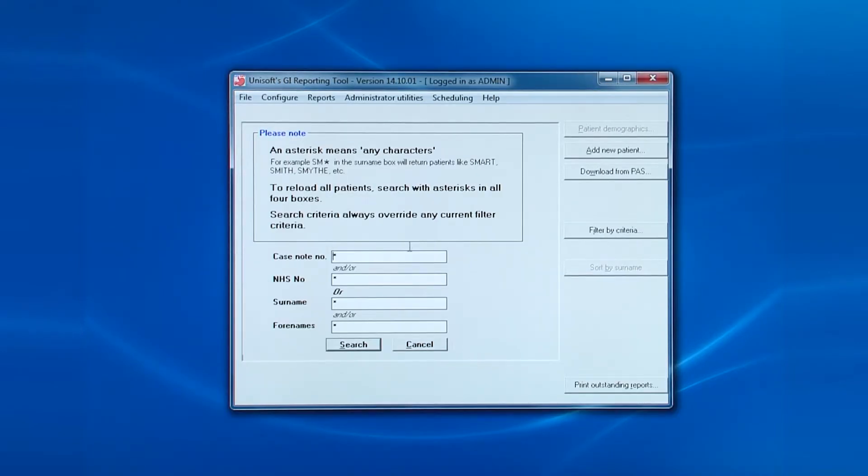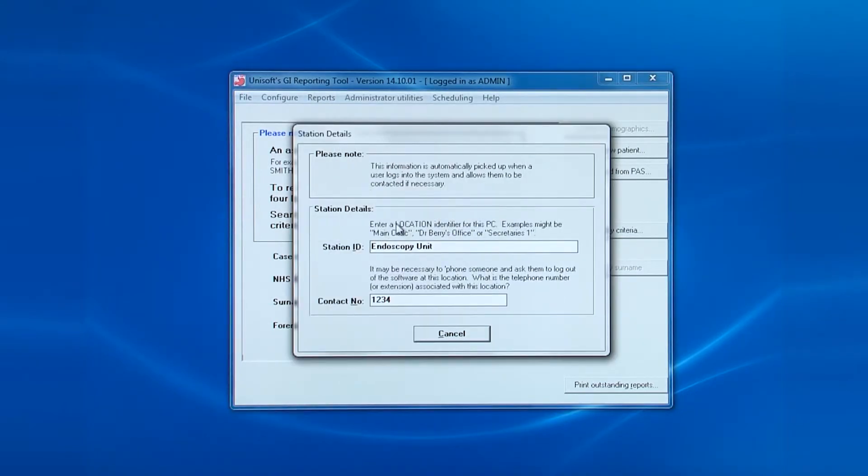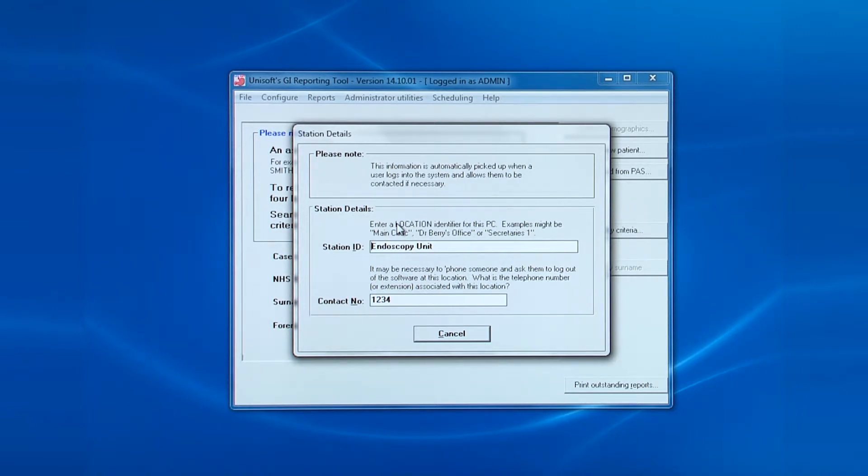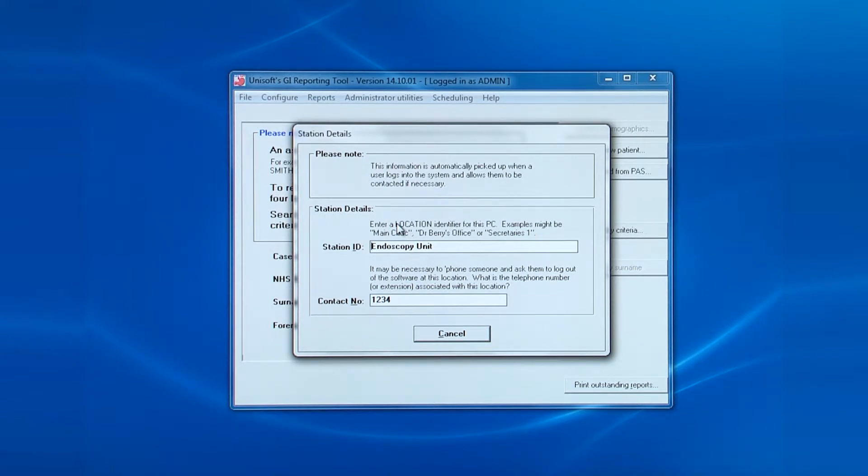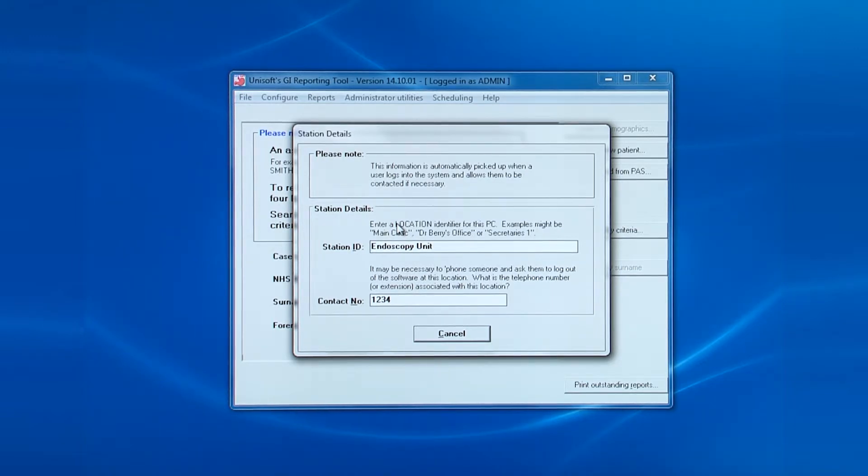The next entry is change the station ID. This is the location of the PC and adjacent telephone number. This is so that the software can tell a user that a patient's record is locked by so-and-so and on which PC. It's important to note each PC must have its own unique ID to prevent users getting an unexplained message saying they've been logged out by a user with administrator rights.